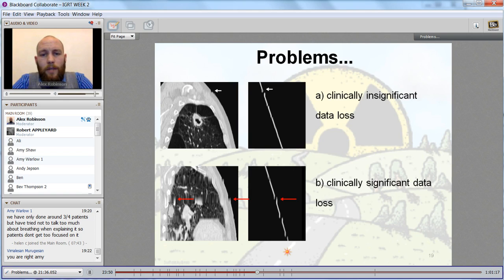Okay, so what we could do with the Siemens system is do a slow breathe scan. Now, in the slow breathe scan, the gantry remains at the same speed. The only thing that we do is we use a reduced pitch. Because the bed is now moving through slower and slower, literally at a snail's pace, that means that the length of our scan is reduced. Because as I mentioned before, the scan can only be on for 90 seconds. So if we're unable to scan the entire lung due to this 90 seconds, then once again, we're not going to be able to have our volumes for planning for our DVHs.